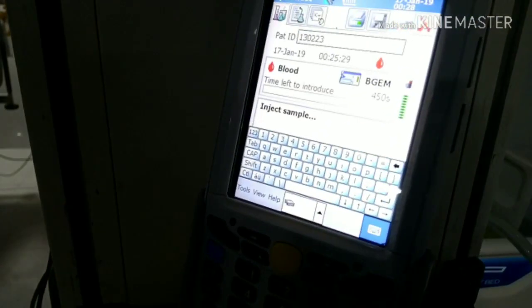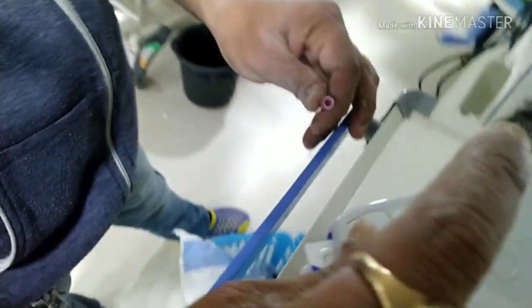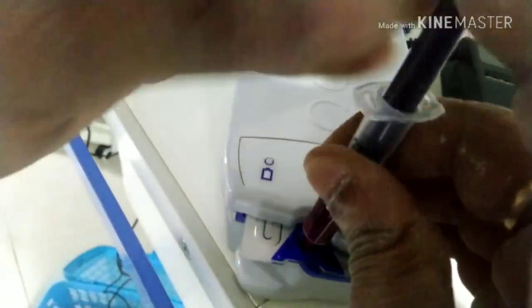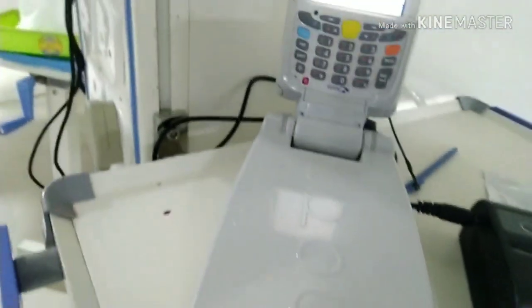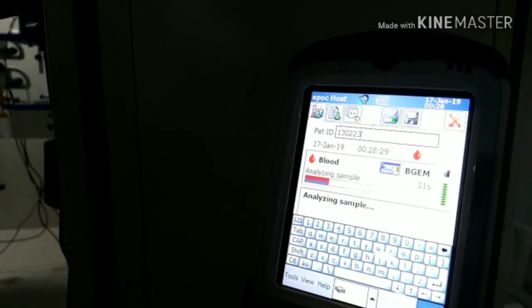Calibration is over. Now the exact sample of the blood will flow to the card as shown in the picture. Now wait for the analyzing of the blood sample.